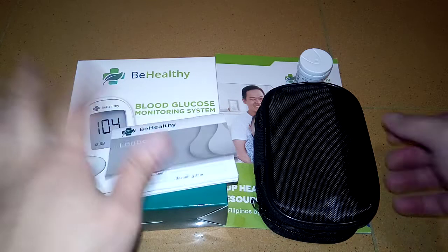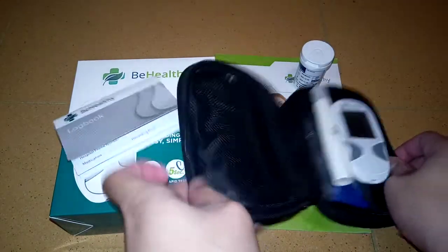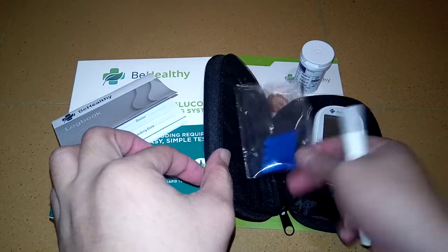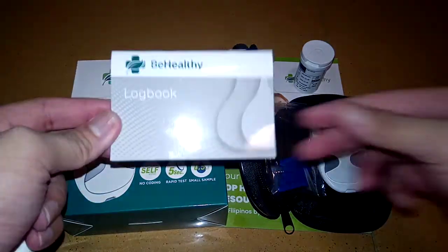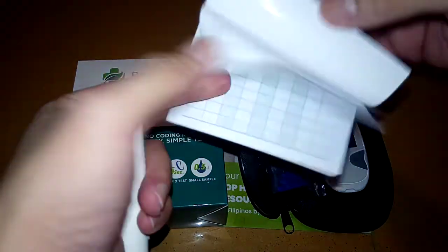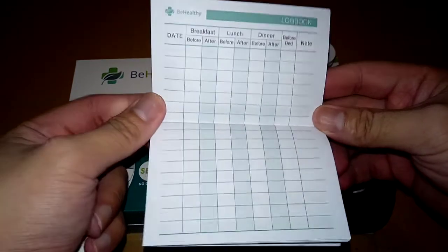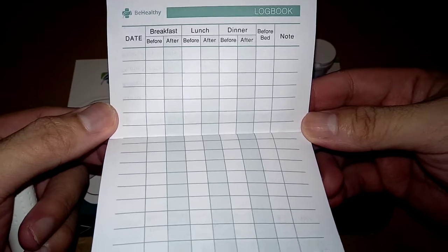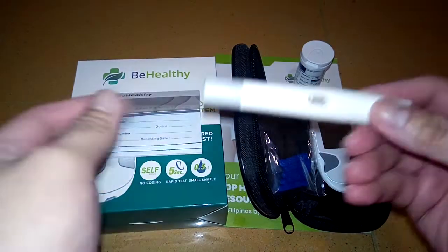In this set, they have 10 strips, lancets, a lancet pen, and the machine. What's great about this is they have a logbook where you can write down your blood glucose readings for every meal — before and after breakfast, lunch, and dinner — so you can keep a record.